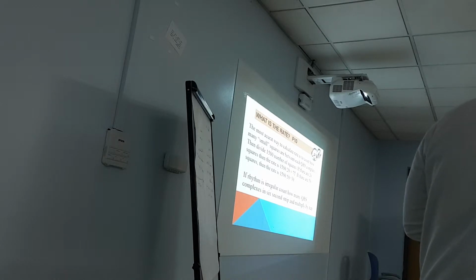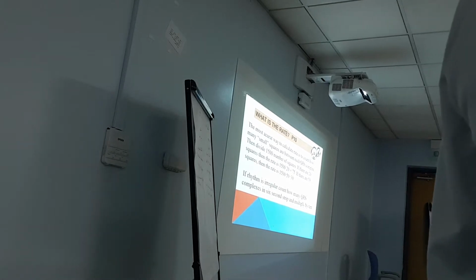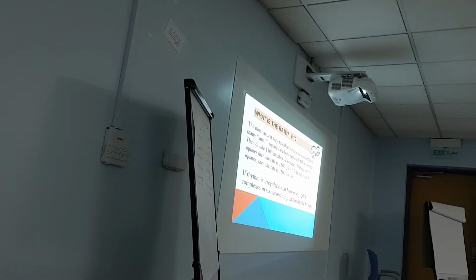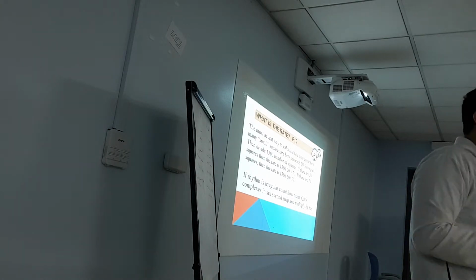Okay? Then identify the rate. I told you how many large squares in 60 seconds? 300. How many small squares in 60 seconds? 1,500. Okay? How about I will say how much one beat takes? How can I know this beat takes how many large squares? I will measure the beginning of one beat to the beginning of the second beat, and then let's say 5 large squares. So this beat takes 1 second. If it is 3 small squares, so it's less than 1 second. So how can I know? Measure this distance and divide the 300 by this number.